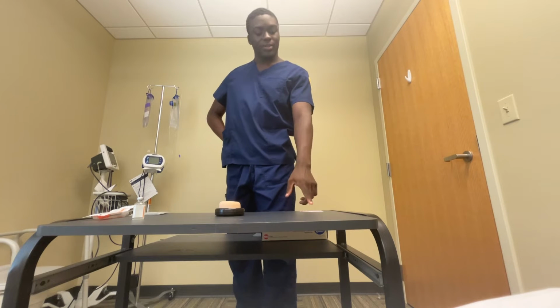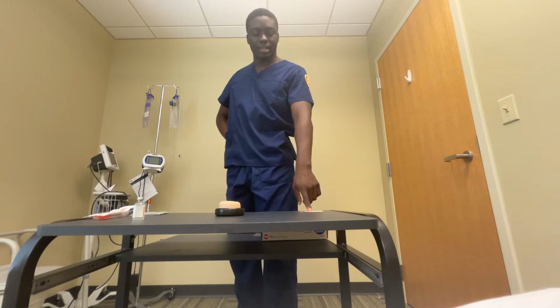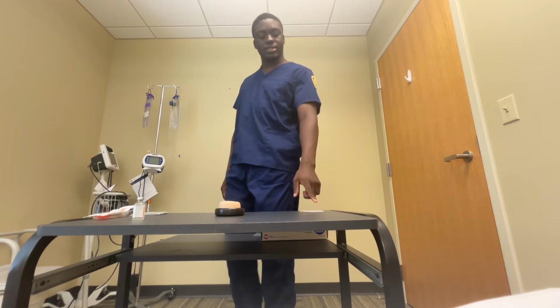Today I will be performing an intradermal injection. First, I will start off with my orders, which is purified protein derivative, 0.1 milliliter intradermally times 1 dose. And then I will align that with my 5 rights of medication, ensuring that this is the right medication.